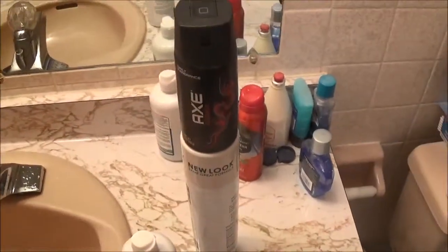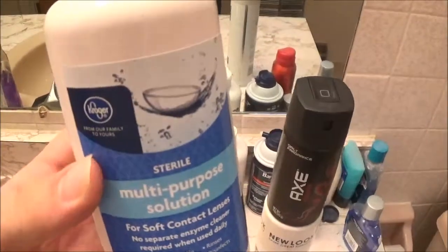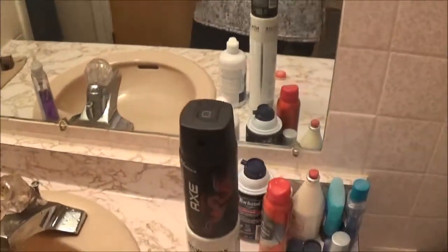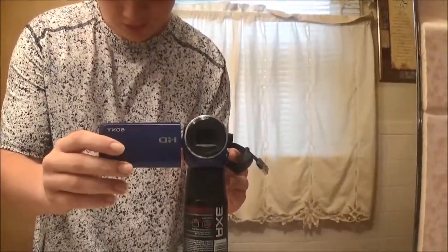And so this is the final step, removing the contact lens. So I said only 2 steps, and I forgot to mention, you also need contact solution in order to do this step successfully. This is the brand I use, Multi-Purpose Solution. You can use that too, which is my dad's, which I'm going to need another bottle. Don't use saline solution, that's for a different type of contact. But anyway, I'm going to set this back on my setup.